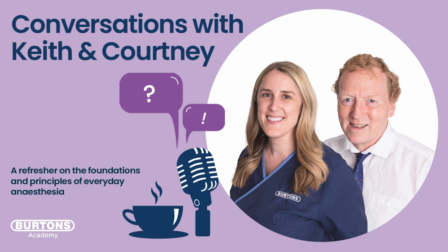I often think, in my patients that are under anesthesia, where the pulse ox has trended down and it's telling me that they're hypoxemic, now, correct me if I'm wrong, but perhaps this is just how my brain's been thinking of it for a few years. When I've been providing 100% oxygen as well, and often as that trend goes down, the first thing I think, I trigger straight away, is oxygen delivery impaired. Am I going to start ventilating? Am I going to give those puffs? Am I going to start giving them some manual breaths?